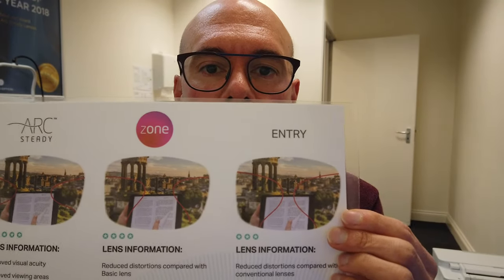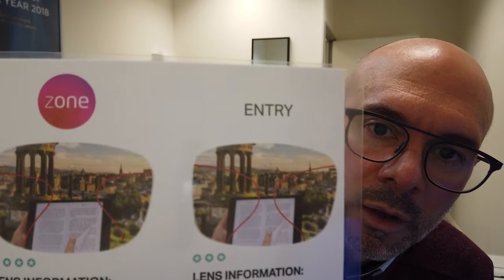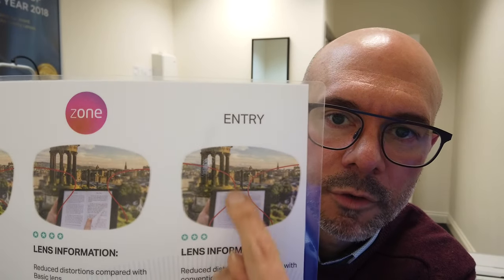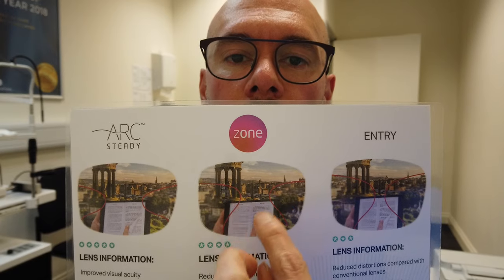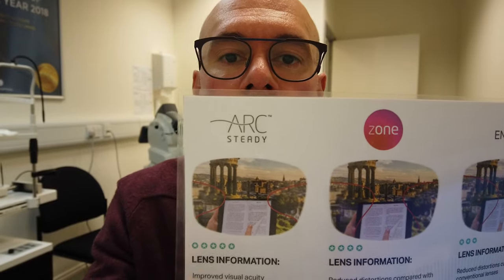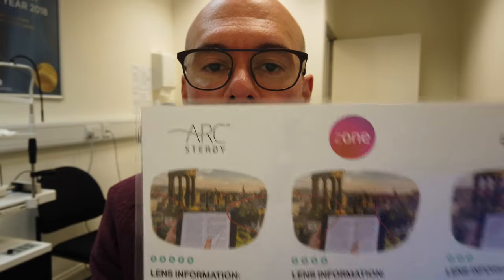The easiest way to show you the differences in design is with a picture. This is a more basic varifocal — you can see the red areas showing more distortion and a very narrow corridor of clear vision. That's an entry-level lens. Then we've got mid-range lenses with less distortion and a wider area of clear vision. And at the top of the range, with the most advanced design, you've got even less distortion and even wider areas of clear vision.